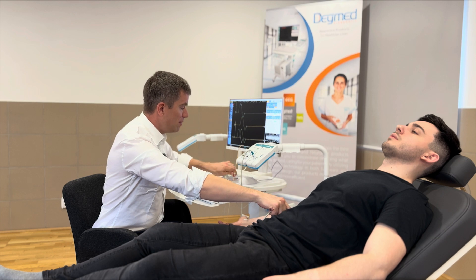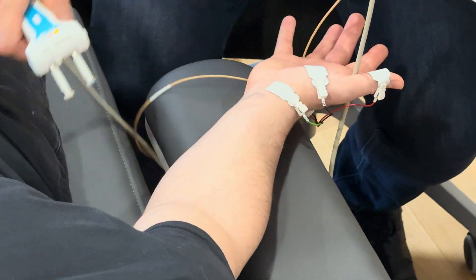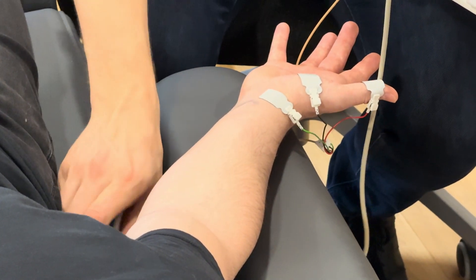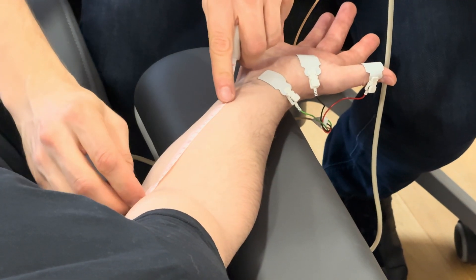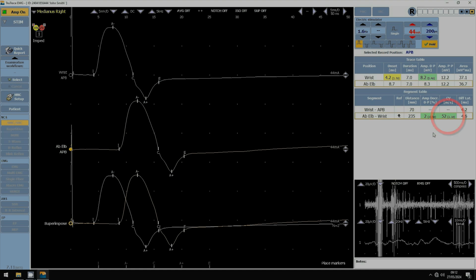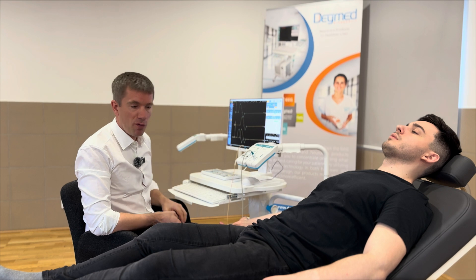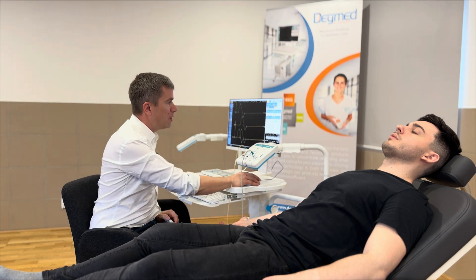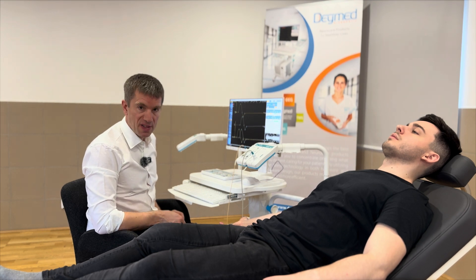In order to get a good measurement of the velocity, I put a marker on the place where I put the cathode of my stimulator. We measure in millimetres the distance between the proximal and the distal stimulation: 235 mm. The conduction velocity is 52 m/s, which is a normal conduction velocity. We see that the onset latency is 4.2 ms over a distance of 70 mm, which is also acceptable.